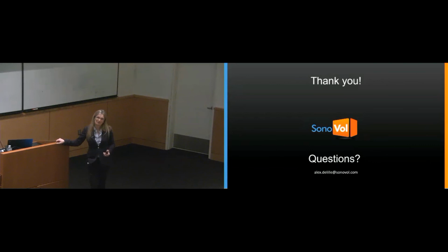And as I was alluding to, you can take your scans early on and you may not be sure of what you're seeing, but then once you see it, you go back and look at your earlier images and then you have more clarity. Or you co-register with BLI, because BLI has such a high sensitivity that you can just detect a couple of cells. But you need to transduce your cells, you need to inject luciferin, and this is basically contrast agent free, unless we go to vascular imaging. So yeah, there's still not one magical technique out there, although MRI probably comes close.